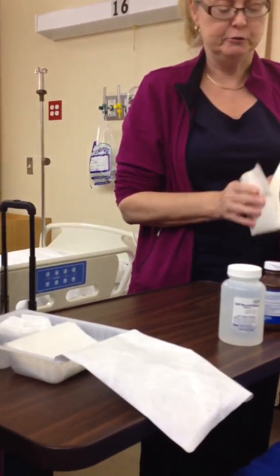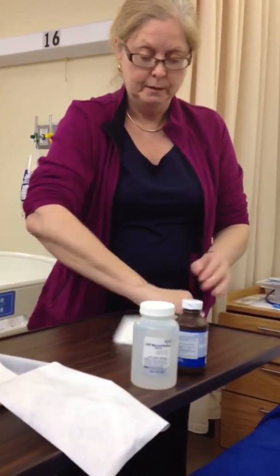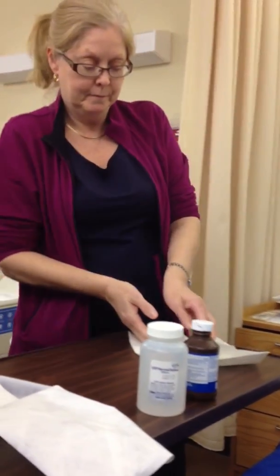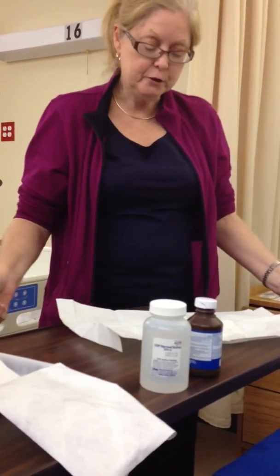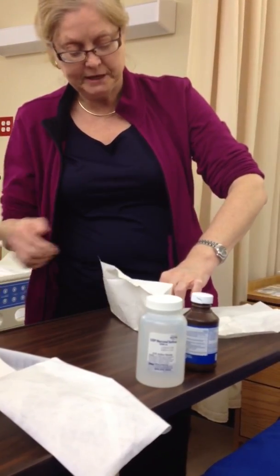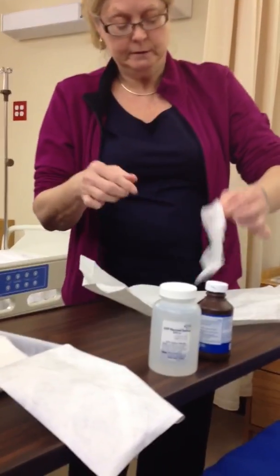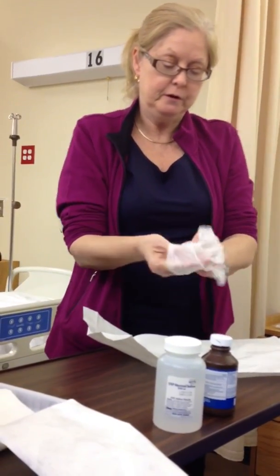Remember, this is the outer rim of the tray, so I can adjust the tray and move it anywhere I want, okay? But where can I not touch that tray? Inside. On the inside. Okay, so here's what I'm going to do. I'm going to get my first glove on. Grip under here. See how your gloves come? So you just do the best you can. Uh-oh. Don't let it fall back. Don't let it get stuck together. And then get your first glove on.